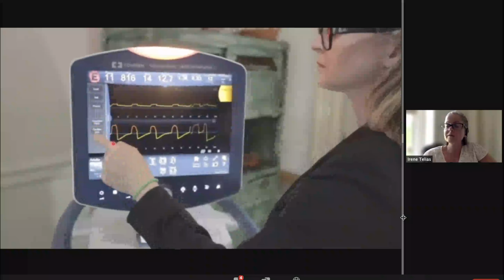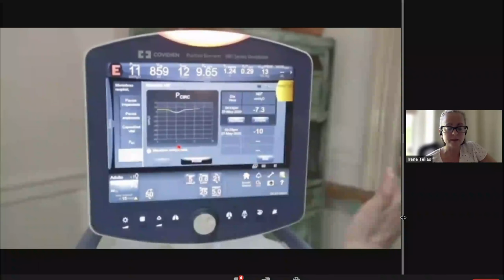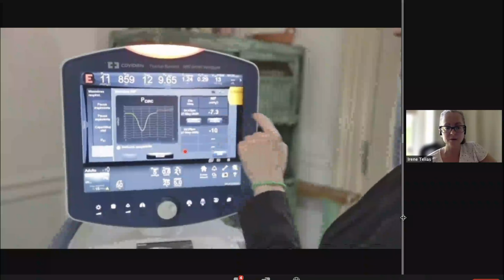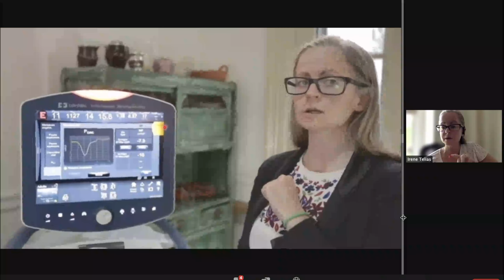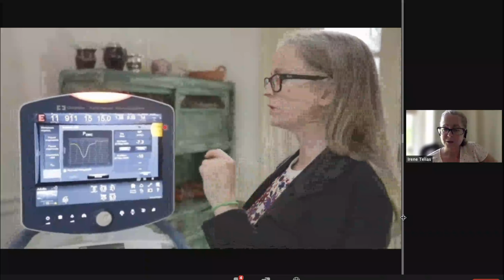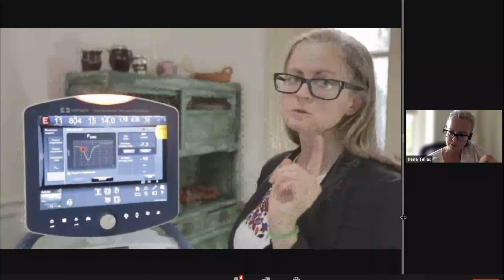So if we want to estimate this low effort by using this non-invasive technique, here we activated the NIF maneuver on the ventilators to measure the POCC. The value for that breath is 7.3 centimeters of water. This is the negative deflection. As I explained to you, we are not so much interested in that breath, but to estimate what the patient is doing in the unoccluded breath.